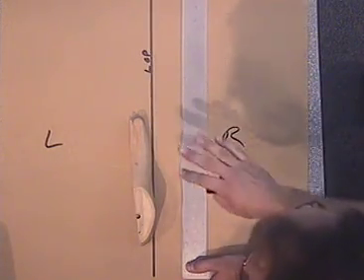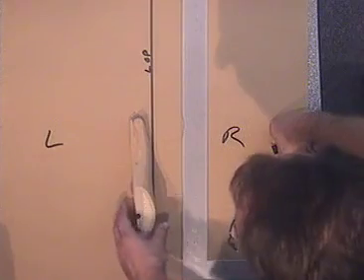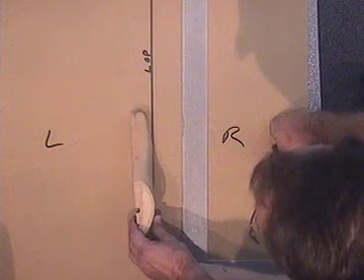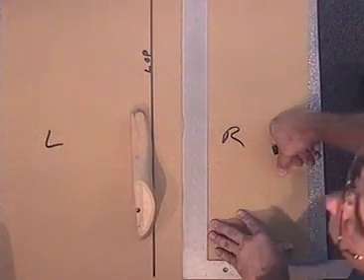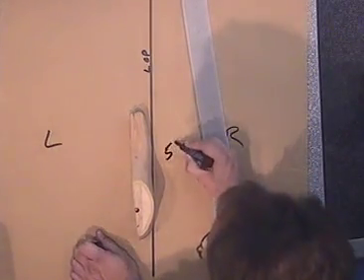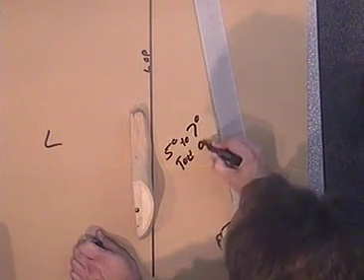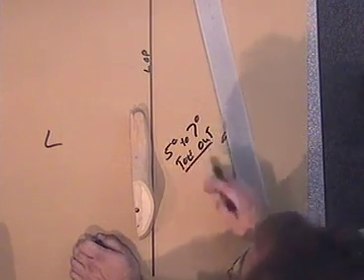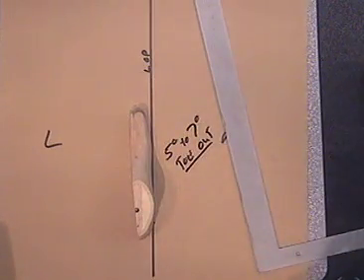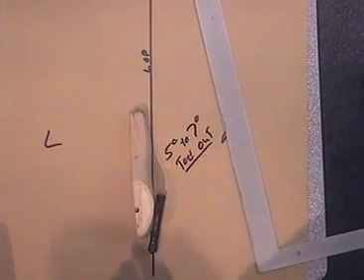So that would be just your standard bench alignment, and it can vary. Some patients have more toe out, some people have less. Now on the other hand, if the patient had toe in, it would be like that. And that's a very odd situation. The prosthesis probably wouldn't function very well if you had the foot toed in. So standard bench alignment value is 5 to 7 degrees of toe out. So by placing the medial border of the heel and the forefoot on the line of progression, you automatically have established your 5 to 7 degrees of toe out. And that's in the transverse plane.